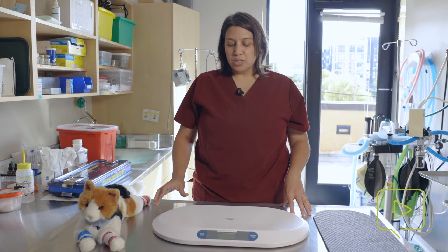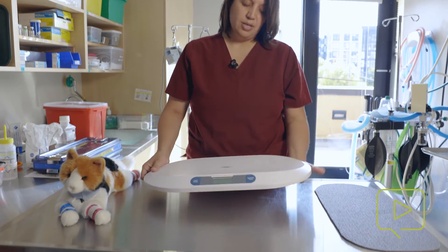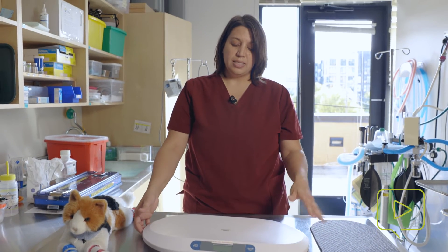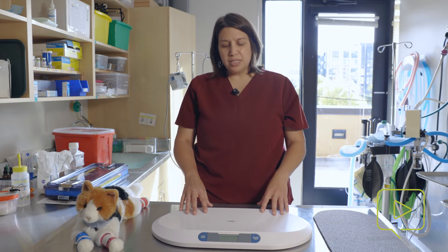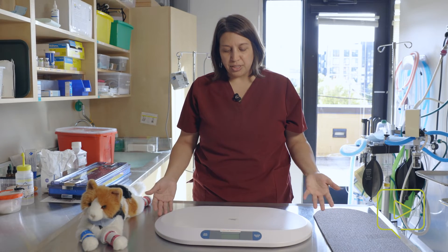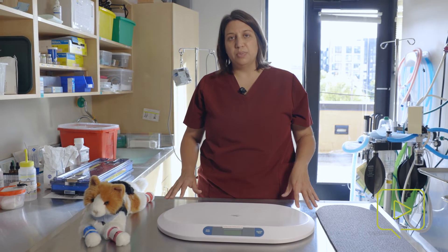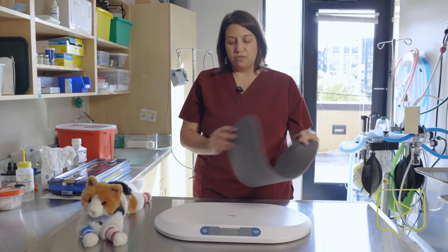Just like with the larger scales, one of the important things to do is make sure that the surface it is on is flat and there isn't anything underneath like cords or towels. Something like a towel that makes it not level could cause errors in the weight that you're receiving, so you need to start on a flat surface. These scales are all really slippery, and the reason they're this smooth material is so that we can effectively clean them between patients. But it isn't always comfortable for animals that might have ambulation issues where they feel like they're slipping and sliding, so we often use mats that can help a patient be more comfortable on the scale.